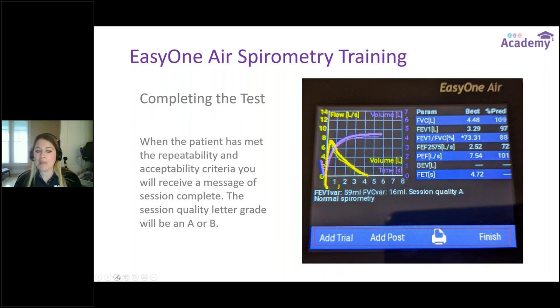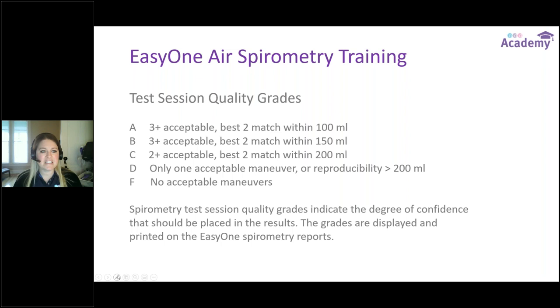When the patient has met both repeatability and acceptability criteria, you receive the Session Complete message in the coaching bar. You always want to end a session with a quality letter grade of A or B. Think of it like school — we want an A or a B. An A means three or more acceptable, very reproducible tests with two of those trials within 100 mLs of each other. The grades go down through F, meaning no acceptable maneuvers. Session quality grades indicate the degree of confidence that can be placed in the results and are printed on EZ1 spirometry reports.